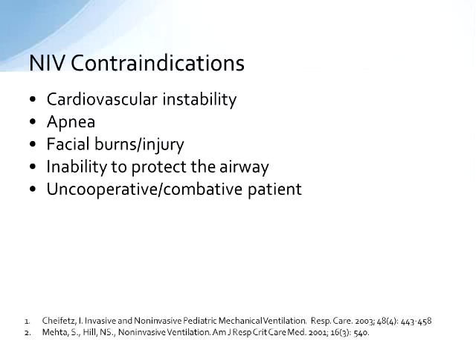So some contraindications. Patients that have significant cardiovascular instability, if they're on vasopressors, you really probably wouldn't want to do this. You'd want to put them on invasive mechanical ventilation. To be on non-invasive ventilation, you have to be participating. So you can't be apneic and placed on non-invasive ventilation. You must be able to trigger the machine.